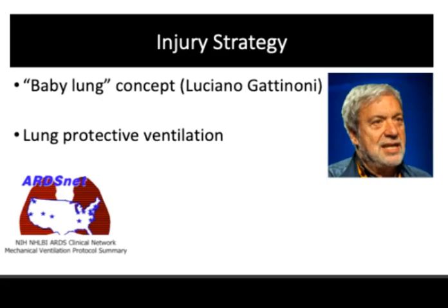Historically, mechanical ventilation of the lungs used to utilize relatively large tidal volumes. The number one goal was to normalize blood gases, in other words, to have high PaO2 and normal PaCO2. And it did not matter what ventilator settings needed to be used to achieve this aggressive end goal.